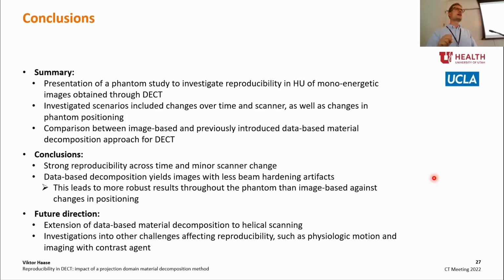So we have not only looked at the scatter estimation, how it changes for the positioning of the phantom, but it's rather our method that we use. It's rather simple because we just have understood that it's necessary. Otherwise, the forward projection model would not work because it assumes scatter free data. But it's just a row-wise estimation for scatter with two simple parameters. So yeah, it's very simple, so that everything works after that. But I think that this is something that can definitely be improved.